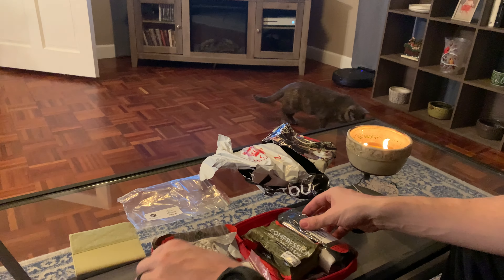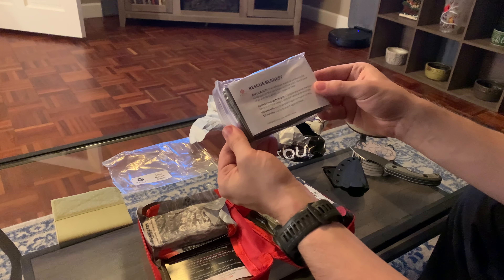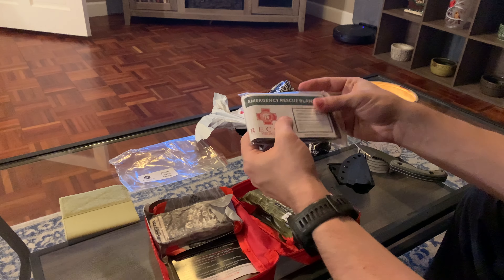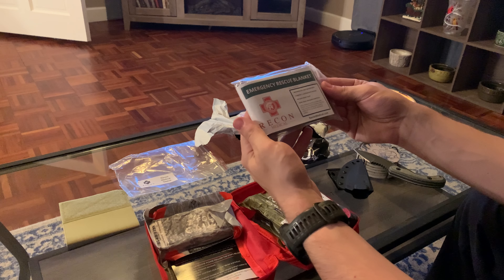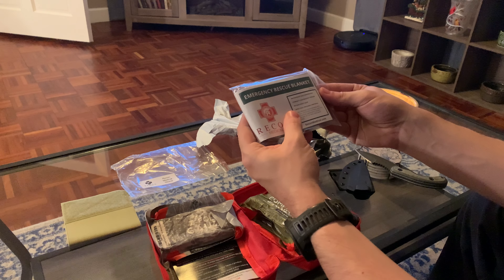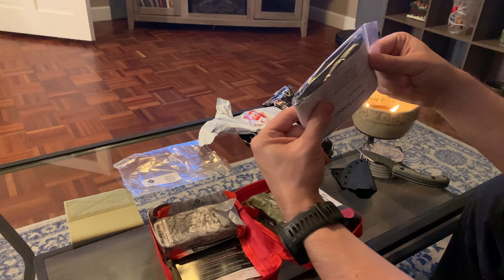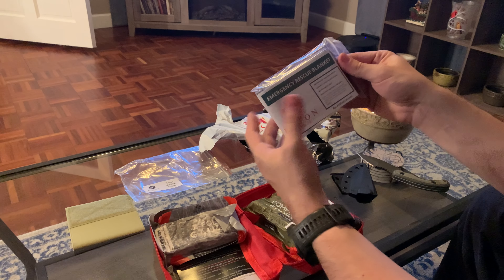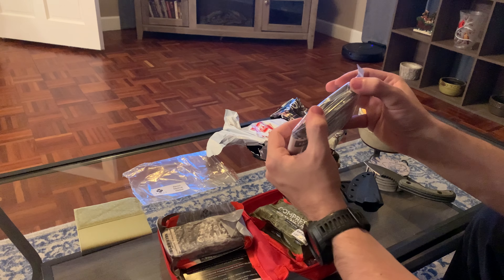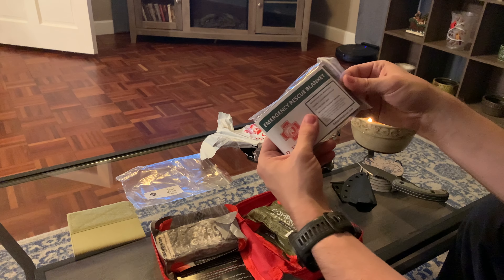It's a nice bleed kit — says Recon Medical. First things I notice: it's really lightweight, really nice, just a little canvas bag — good to keep all your stuff in. It's cool to have 'bleed kit' labeled on it. I have a bunch of different medical bags and pouches, so it is nice when they're labeled — makes things a little bit easier, especially when the adrenaline's going and you really need a certain item.